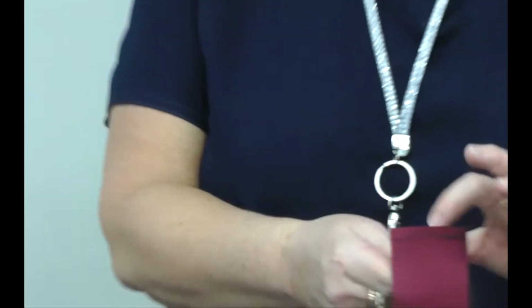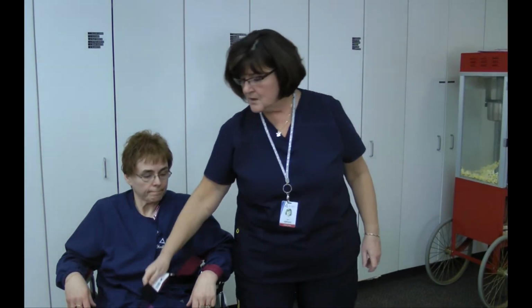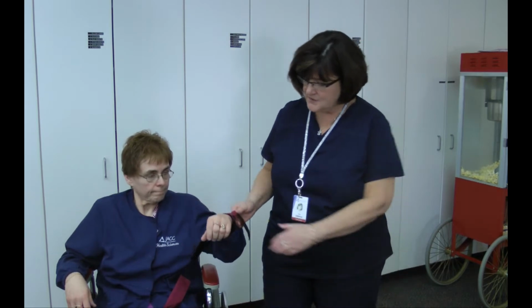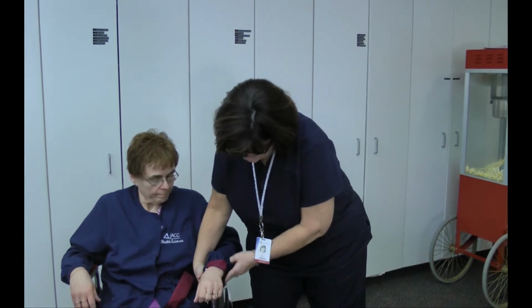Now, one of the reasons it has Velcro on it, every restraint has to be released with one pull. It cannot have a knot in it. It can't have apparatus where it's locked or a fastener of any kind. It has to be able to be released with one pull. Why do you think that's important? Well, if there was a fire or we needed to get Melissa out fast, we could do that with one pull.